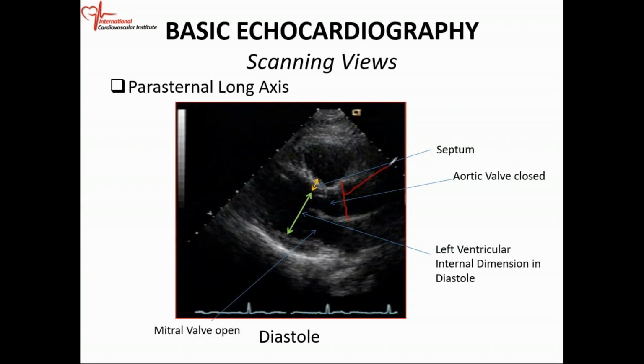You're going to measure it in diastole. We call this the leading edge to leading edge, so from the upper portion to the upper portion.